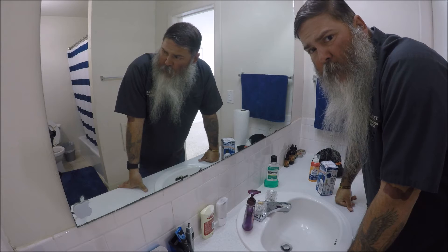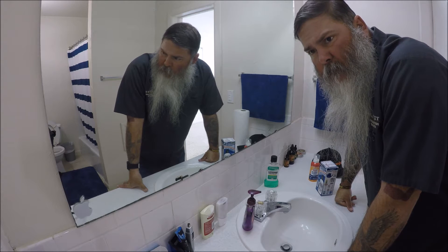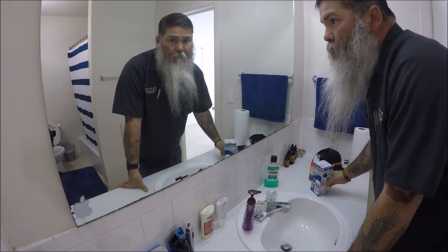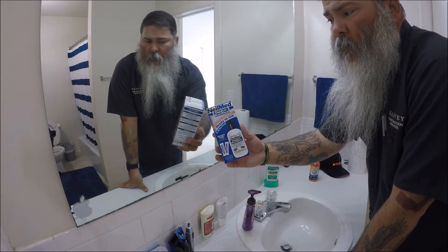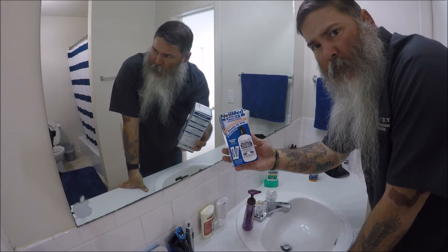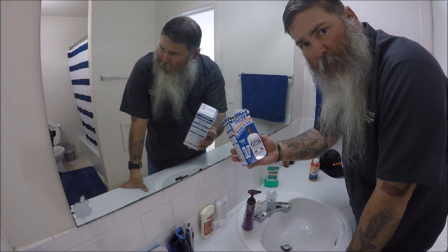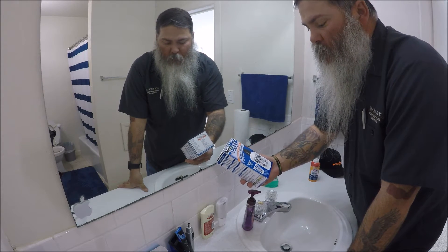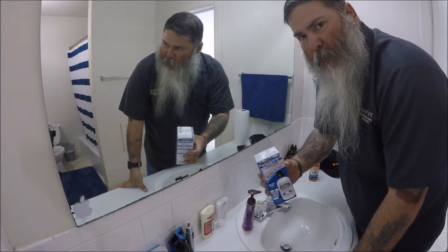I got a little bit of congestion and I'm going off the recommendation of a couple of folks to try this NeilMed Sinus Rinse. They said it works better than the neti pot because it has a dip tube in it and it gives you a little pressure, so we're going to see how this works.